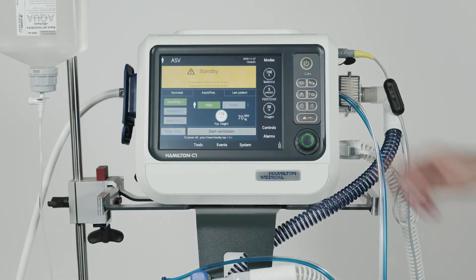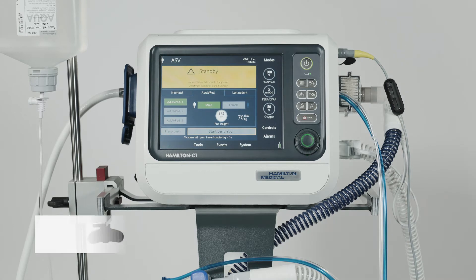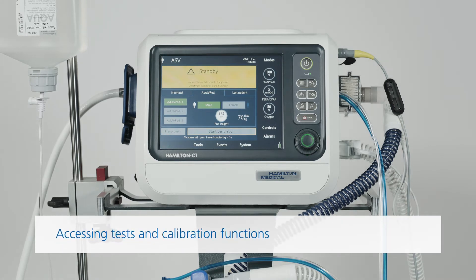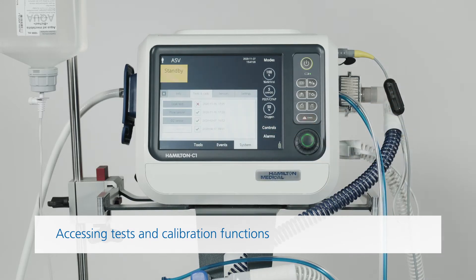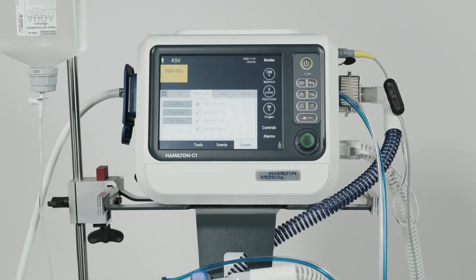Once that's finished, you can go ahead and select the correct patient group. To access the tests and calibration functions, touch Pre-op Check in the Standby window. The Tests and Calib window opens.